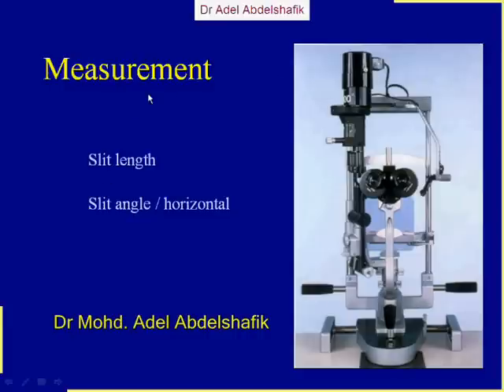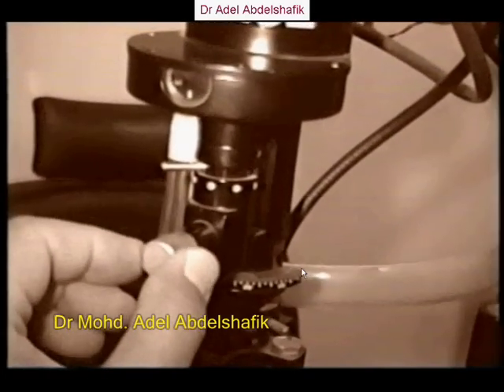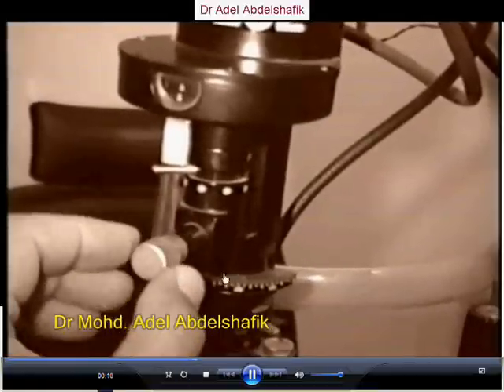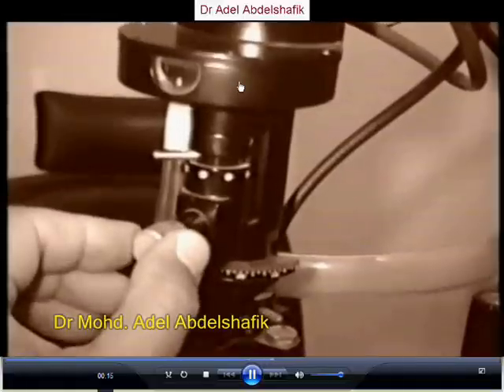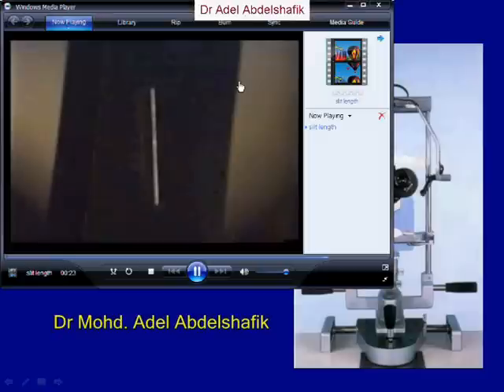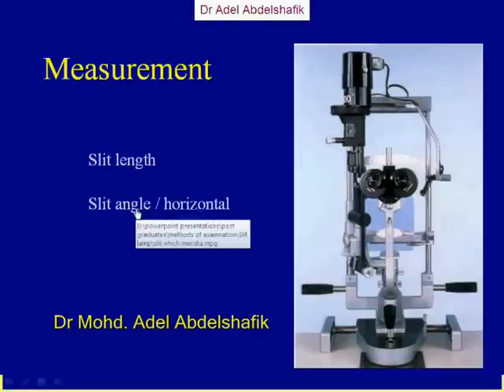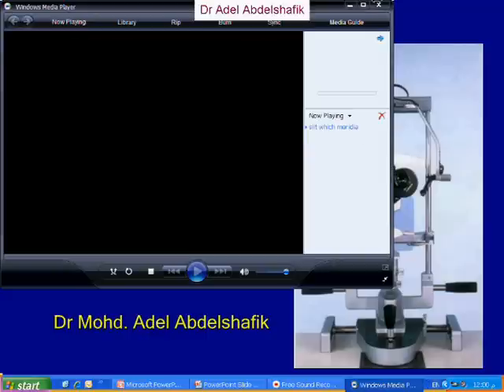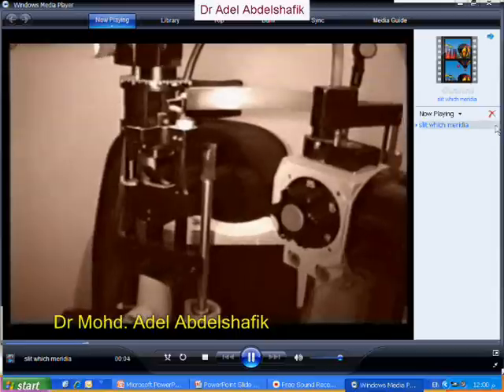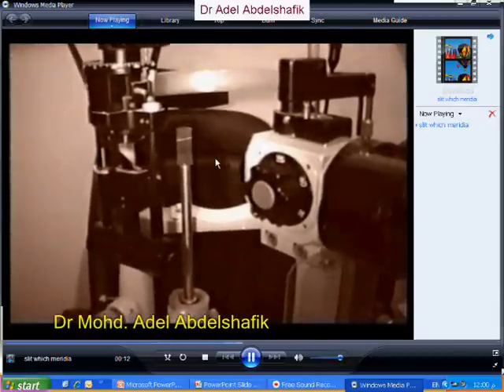Some more things we can make use of the slit lamp is to use it to measure things. The length of the slit light can be read from the slit lamp. We can have a long or short beam. You can read it directly. If you change the length of the beam, you can read from here how many millimeters this length is. Again, you can see that we can tilt the beam. Now it's vertical and we can make it oblique or horizontal.